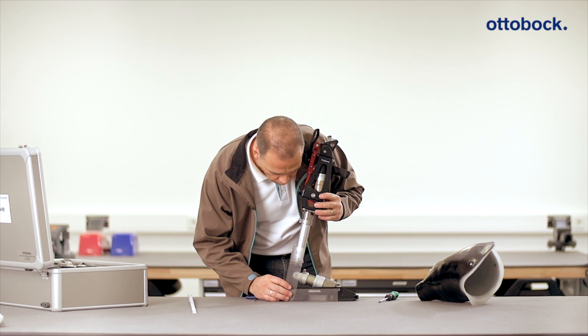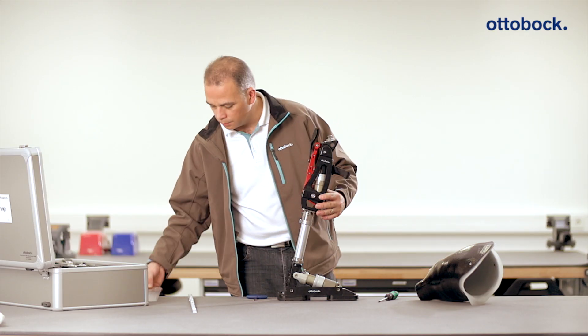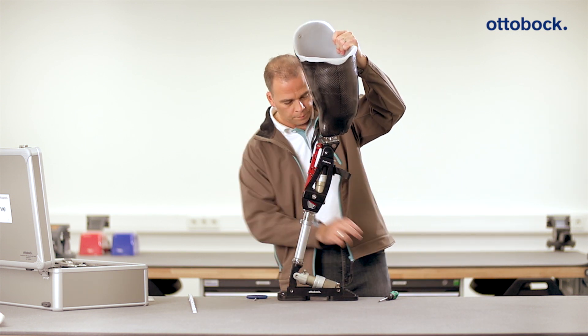The value from the quick reference guide table can be checked with a goniometer and adjusted correspondingly for the selected type of sport and amputation level. Once the components have been connected to each other, the socket is attached. A definitive socket must be used that can withstand the high stresses of sports.